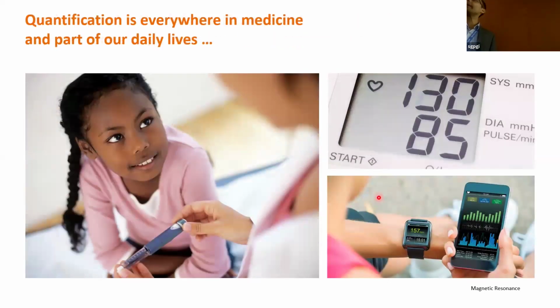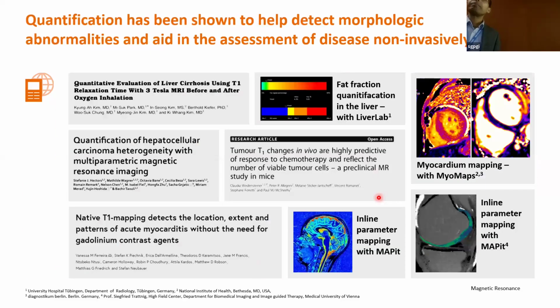We know that the quantitative part in our clinical life is very important. We already have a lot of quantitative parameters available with us, where you can get exact cutoffs of normal versus abnormal, as well as in some scenarios, grading of the disease as well. In MR also, there are methodologies available that talk about quantitative measures rather than the qualitative measures, like relaxometry measurements across anatomies, brain, cardiac, liver, cartilage, and fat quantification for liver. All those things are already available.